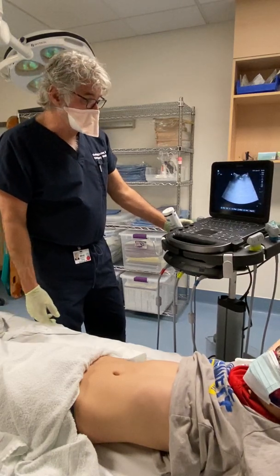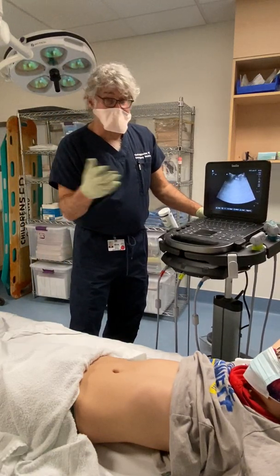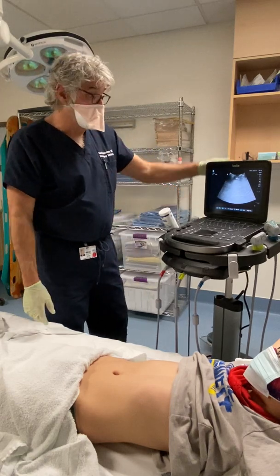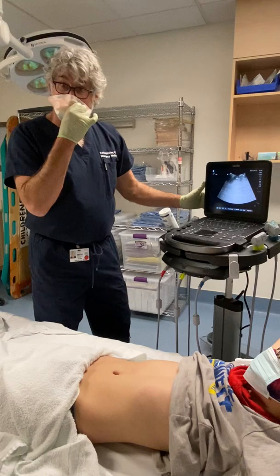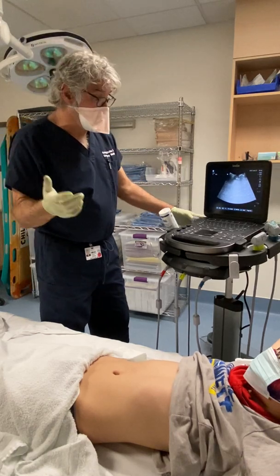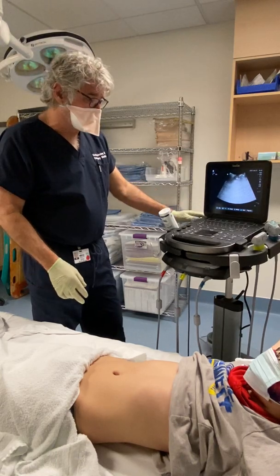Let's talk about the machine in general. This is one of our two ultrasound machines in the department, but in the future you may be looking at a different kind of machine. These are made by Sonocyte. This is our laptop model called the Edge. We have another larger model called the Exporte. They're both basically the same, though you do your calculations slightly differently.